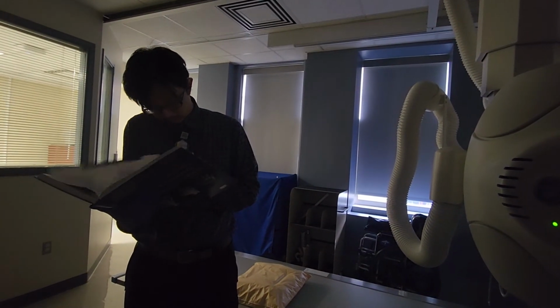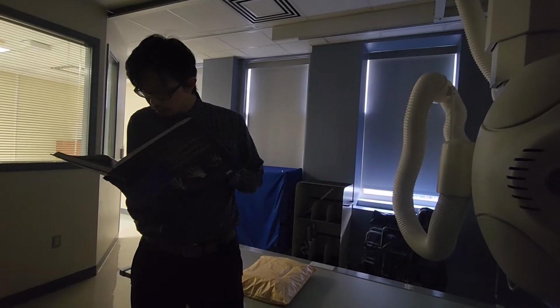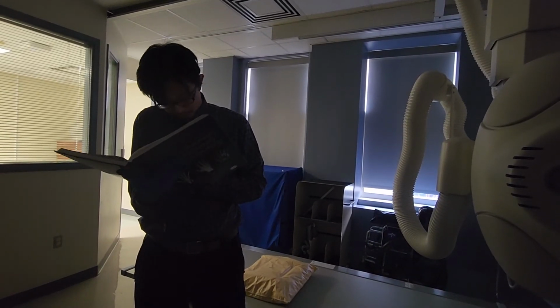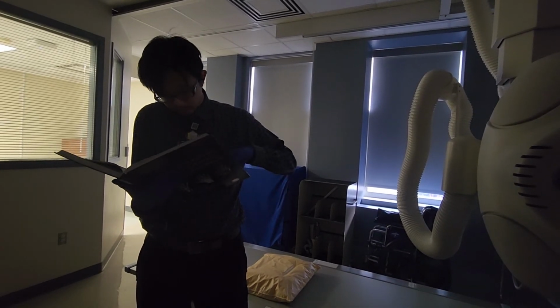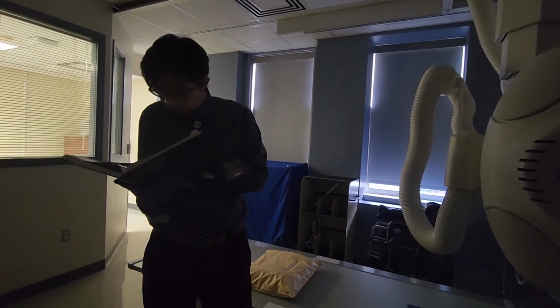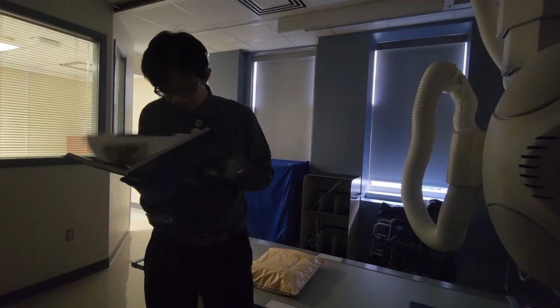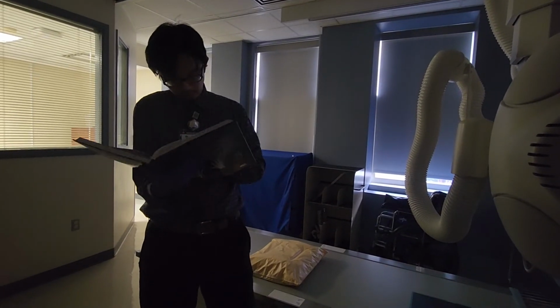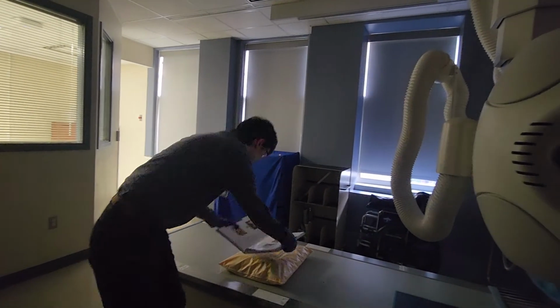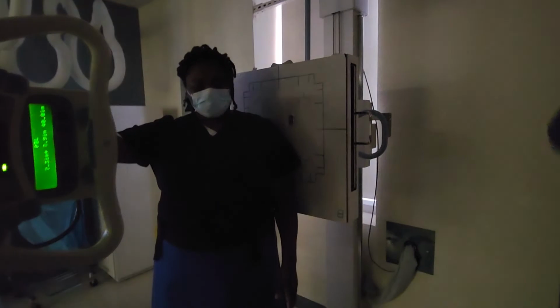Let's see. Grashey method. So respiration is just suspend for the Grashey. And then respiration is just suspend for the normal shoulders as well. So this is the trauma view. Why? So this is not the trauma view Y. Okay. This is the Grashey.